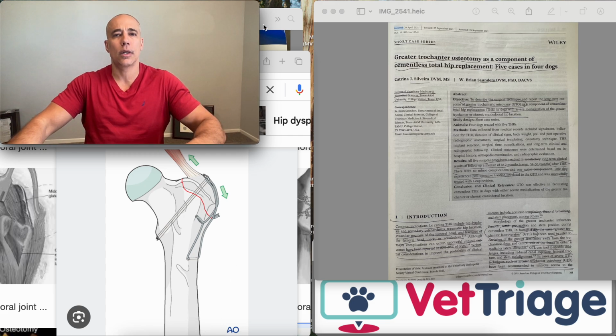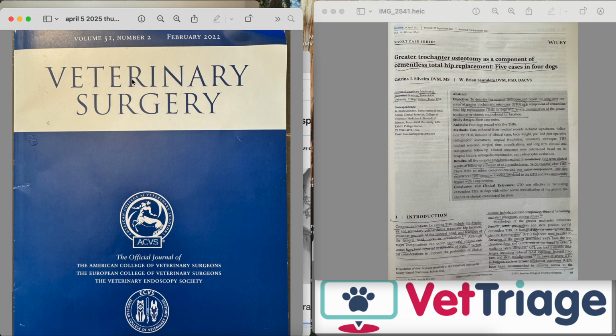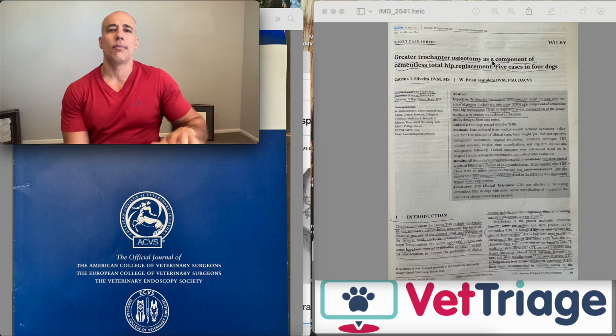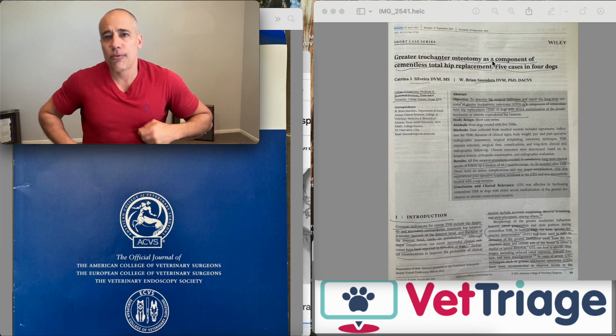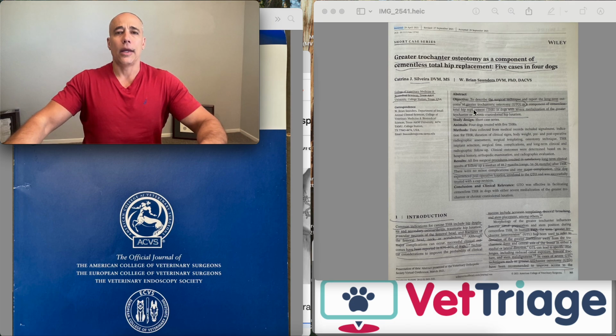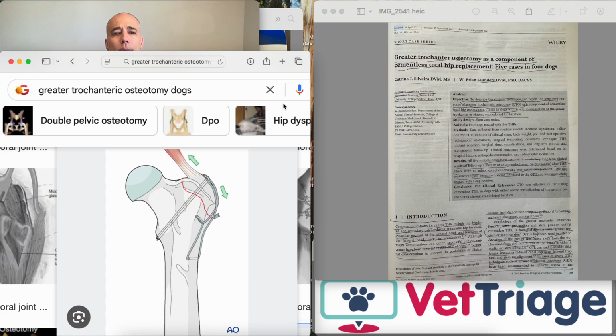We are continuing on with this issue of Veterinary Surgery, February 2022. Greater trochanter osteotomy as a component of cementless total hip replacement in 5 dogs, or rather 5 total hips, 4 dogs. And just to give you an idea of what a greater trochanteric osteotomy is, basically in order to place a total hip replacement in the femoral diaphysis, they're going to make a cut here where this red line is, but of course it'll be straight because it's going to be controlled.